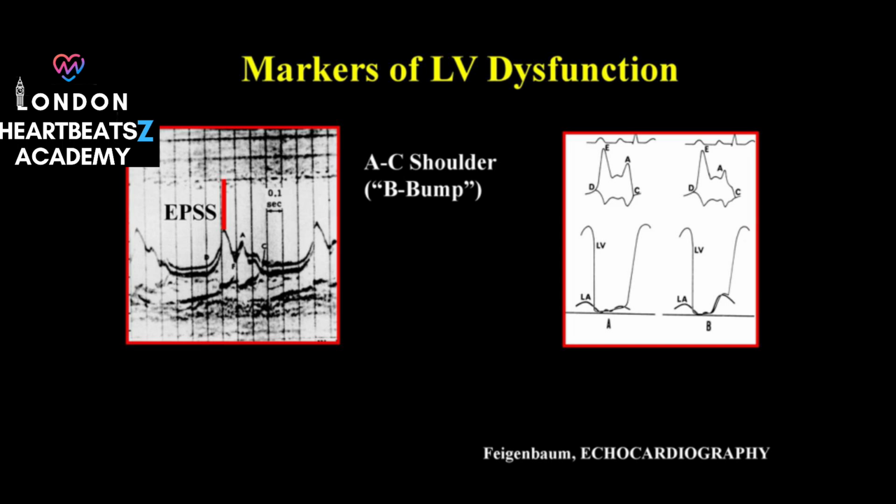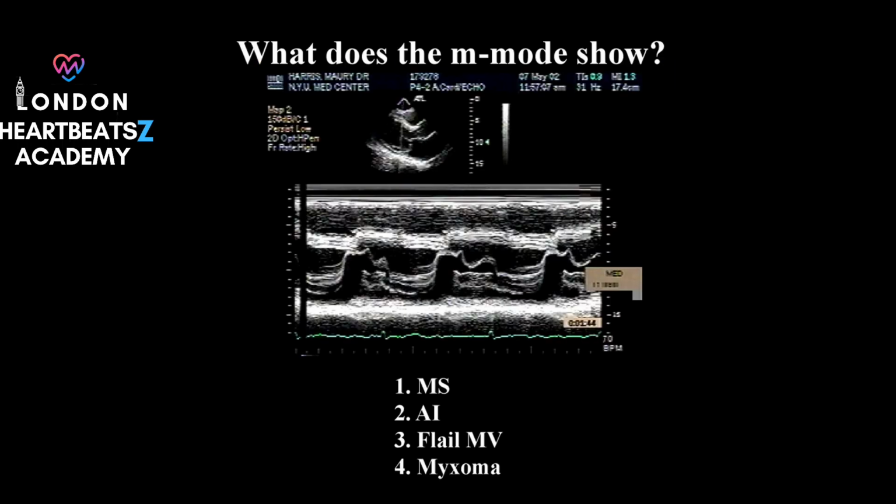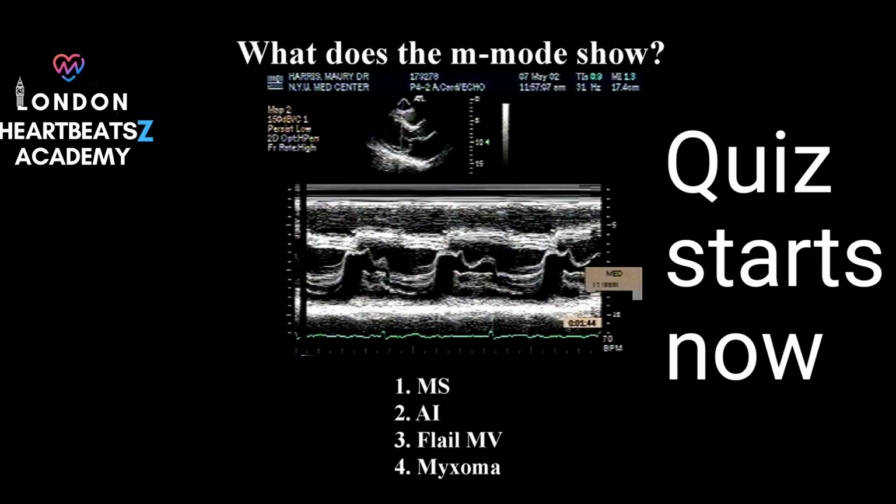So how does M-mode help detect this? M-mode can reveal telltale signs of a large ASD, like a dilated right ventricle, and something called paradoxical septal motion. Normally, the septum, the wall between the heart's chambers, moves towards the left ventricle during contraction. However, with a large ASD, the increased blood flow to the right side of the heart causes the septum to move towards the right ventricle instead. This paradoxical movement, again, is easily picked up by M-mode's high temporal resolution. That's fascinating. It's amazing how M-mode can pick up on these subtle variations in movement and signal a potential problem.